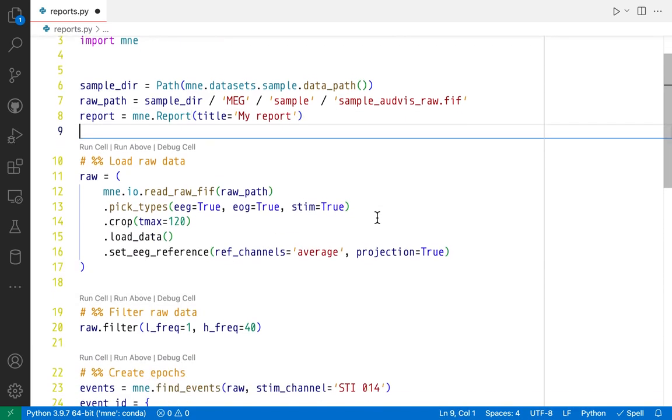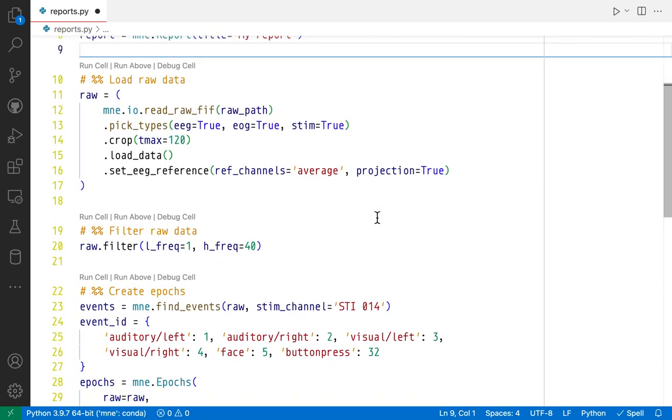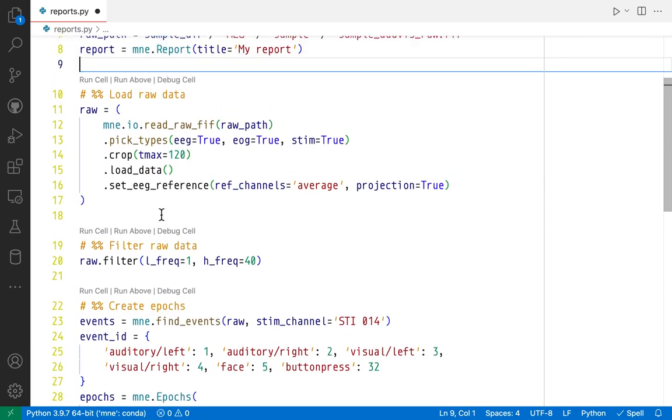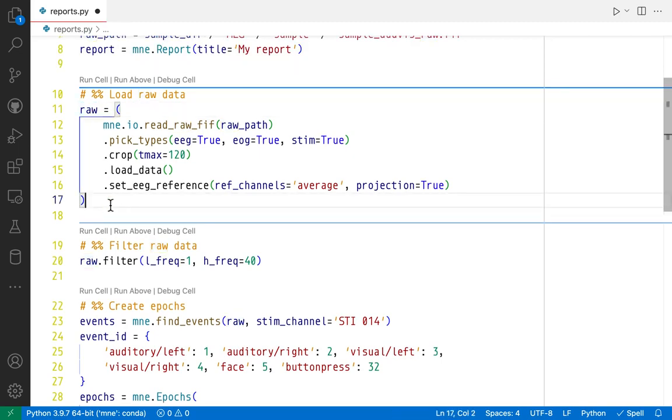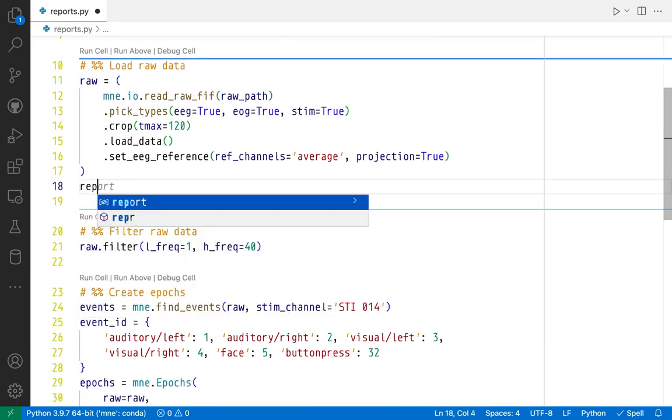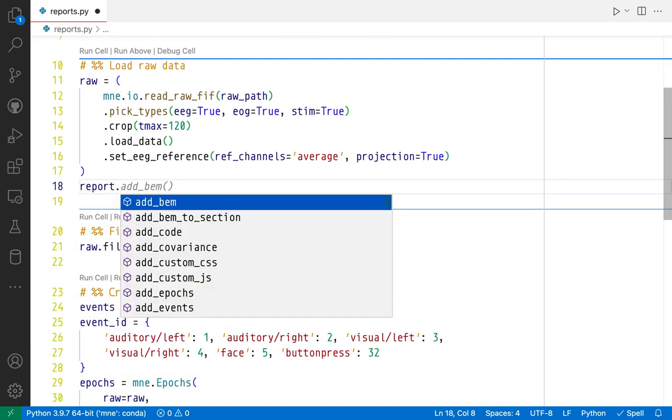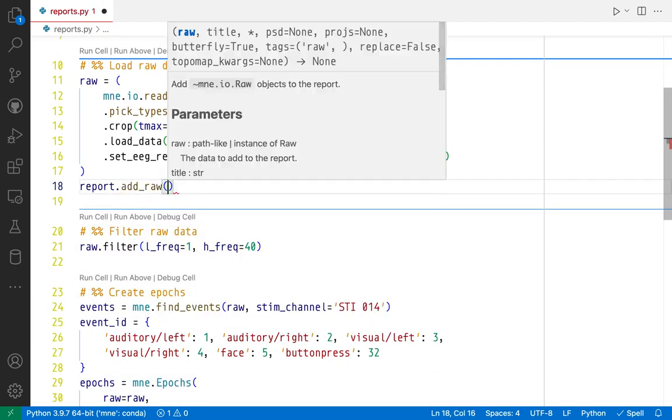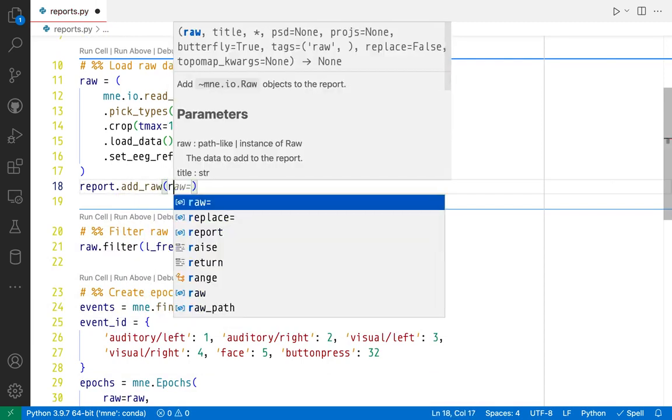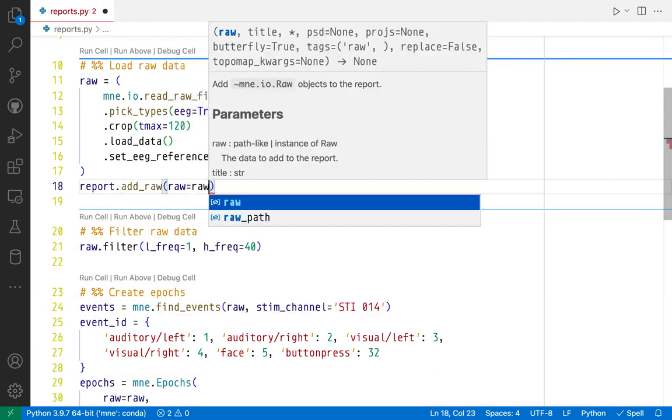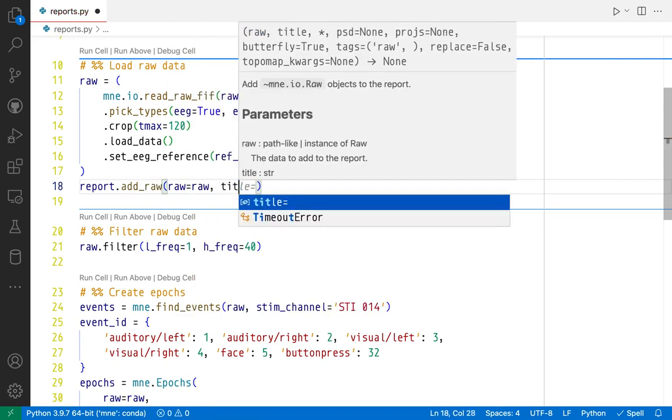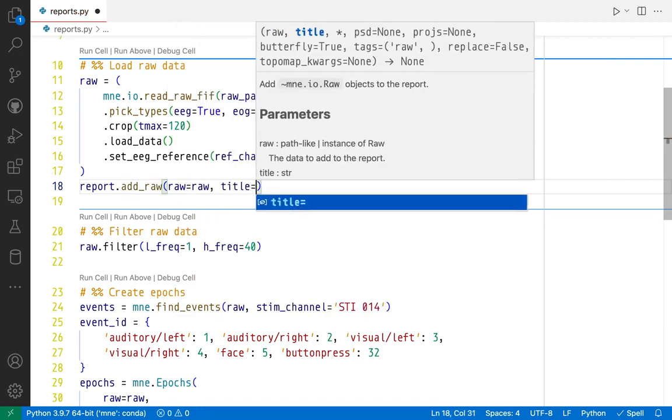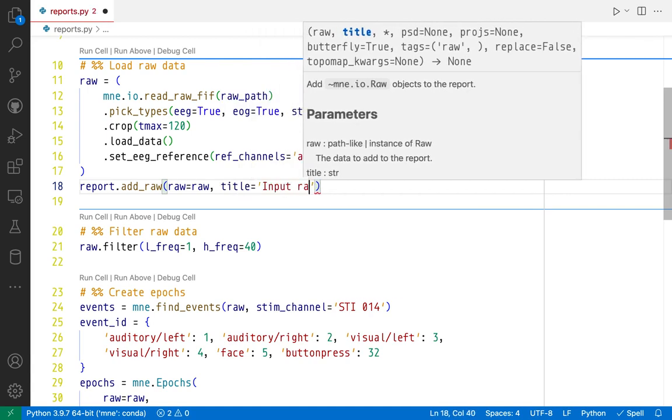So this is an empty report and we can now start filling it with content, for example, with this raw object. To add a raw object to a report, we're going to use the add_raw method. First parameter it expects is a raw object and the second parameter is a title. So let's just call it input raw.